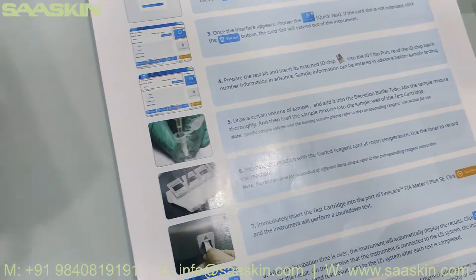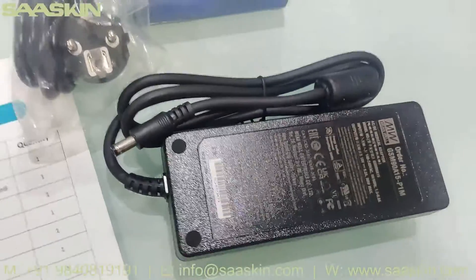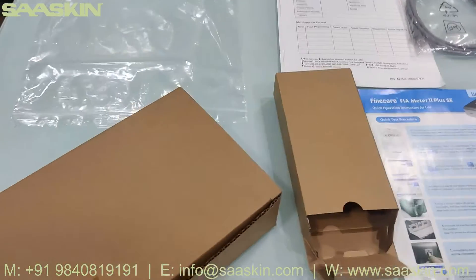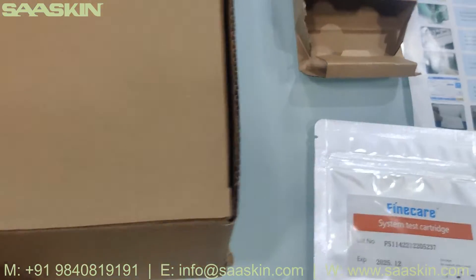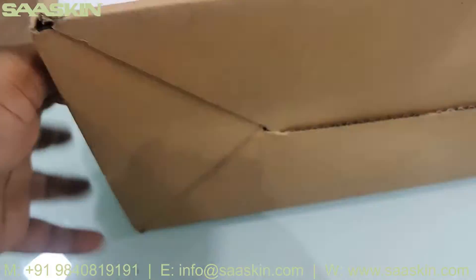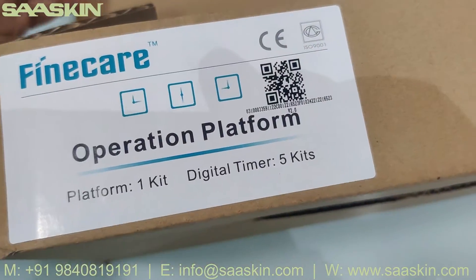There's a power adapter. As I said, there is one more box available here. You can see it says FineCare operation platform.